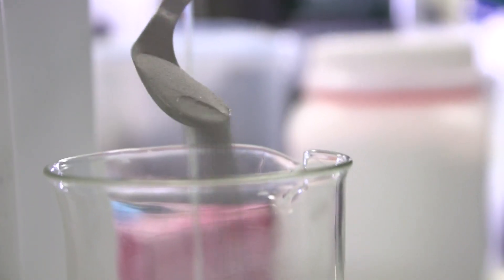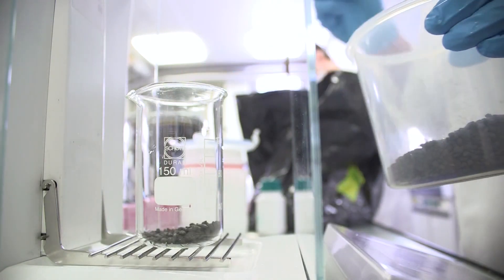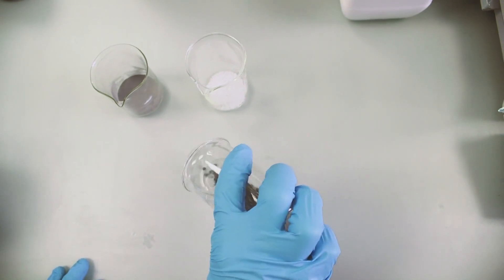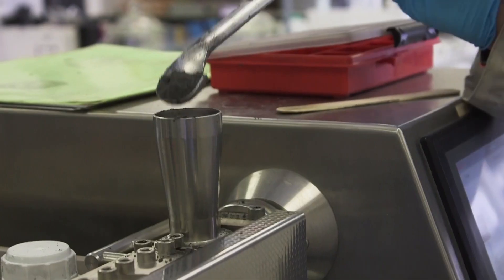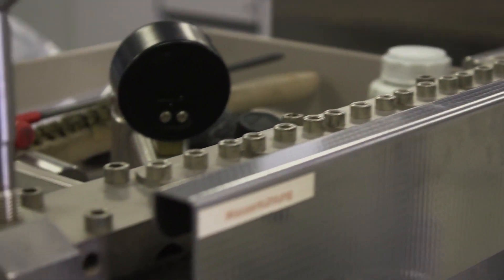For printing magnets, we first had to develop a filament with a high loading of magnetic particles that was processable on a 3D printer. This is quite a challenge. On the one hand, you want to put as much powder in as possible to have strong magnets. On the other hand, you want to put in a decent amount of polymers to make a filament flexible enough to be spooled and stiff enough to be pushed through the printing head.